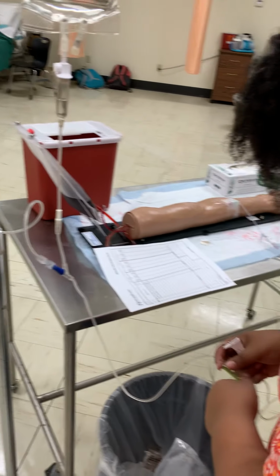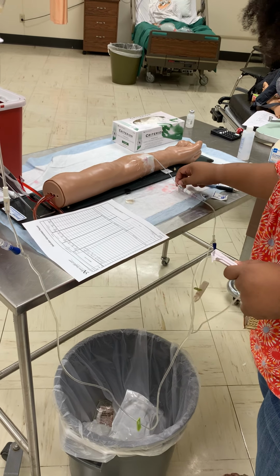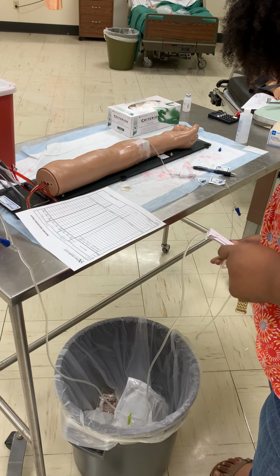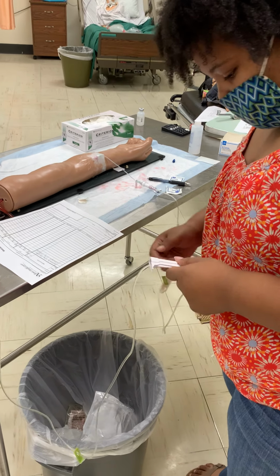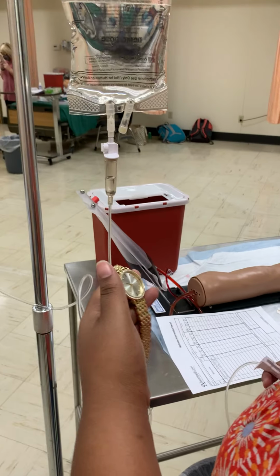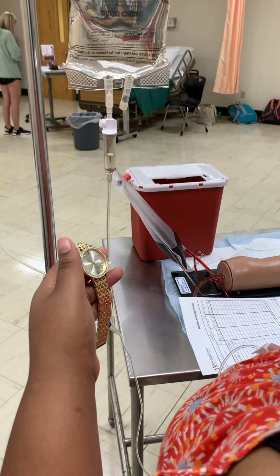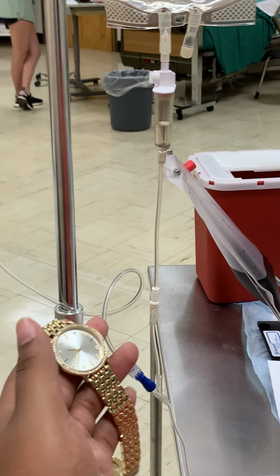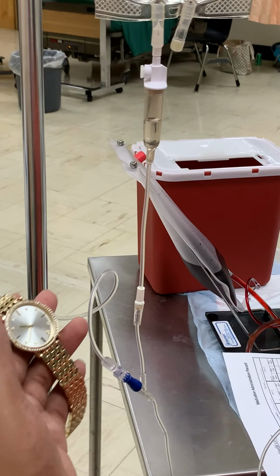Make sure all my lines are open. And at this time, I'm going to regulate my drops.